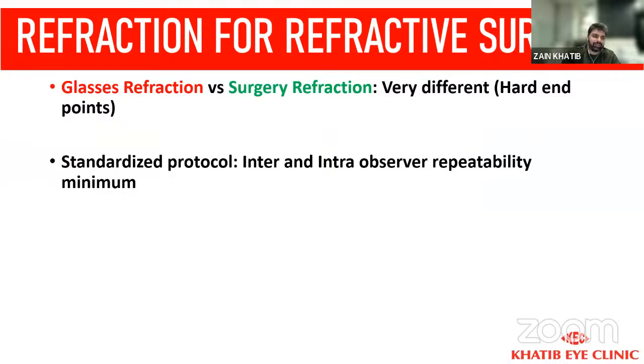One thing that is extremely important when we talk of refraction for refractive surgery is that it will be slightly different from your glasses refraction. For glasses refraction, if a patient comes to you every few years, you may find differences. But from the surgery point of view, our refraction should be very, very standardized, as should all aspects of refractive surgery. In refraction, we are talking about hard endpoints. Whenever we are talking about refraction for refractive surgery, the endpoints where we stop that particular part of refraction should be well defined.